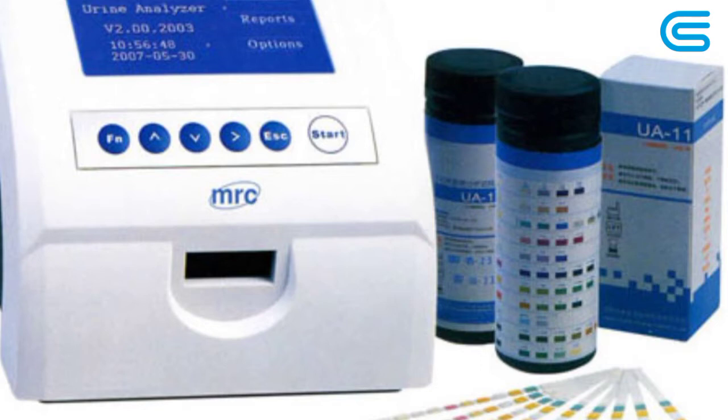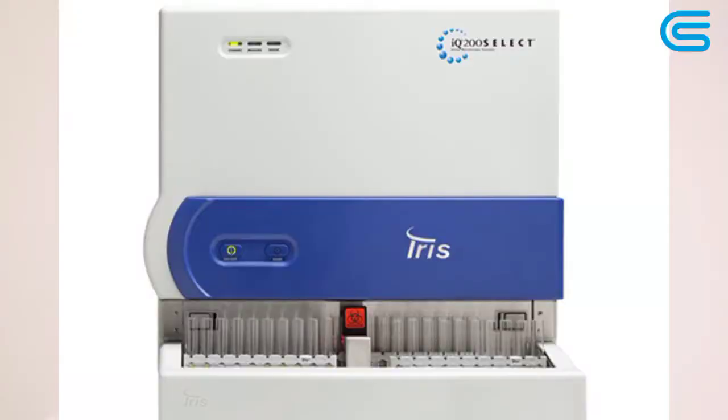Cells are stained with two fluorescent dyes, and electrical impedance and forward angle light scatter are measured. An example is the next generation image-based urinalysis system, the IQ200, a walkaway system that uses flow imaging analysis technology and auto-particle recognition software.